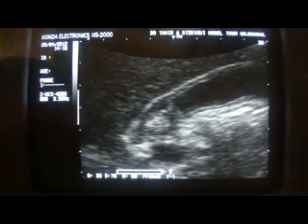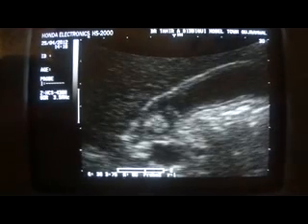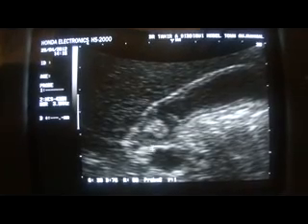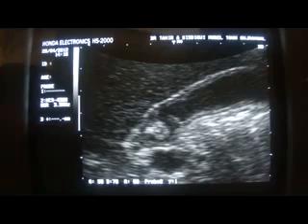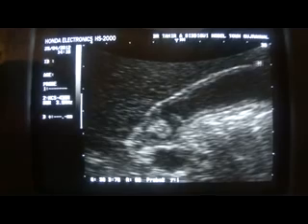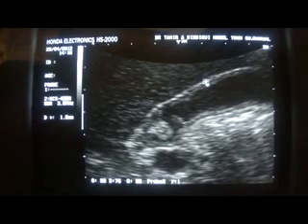The marked area is the slight problem area. You can see the pancreas also — in all cases of gallbladder pathology, the pancreas should be scanned. You must see the pancreas in transverse and in the longitudinal section. This is the head of the pancreas in longitudinal section, and in the center you are seeing a tiny longitudinal structure which is the pancreatic duct.